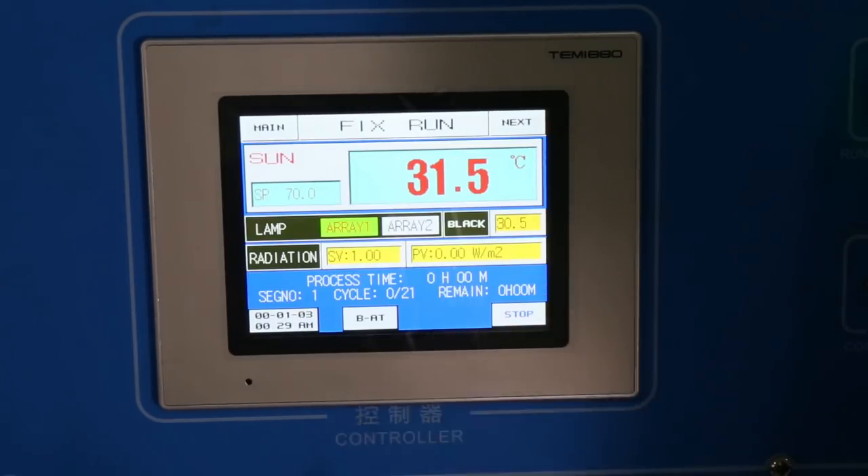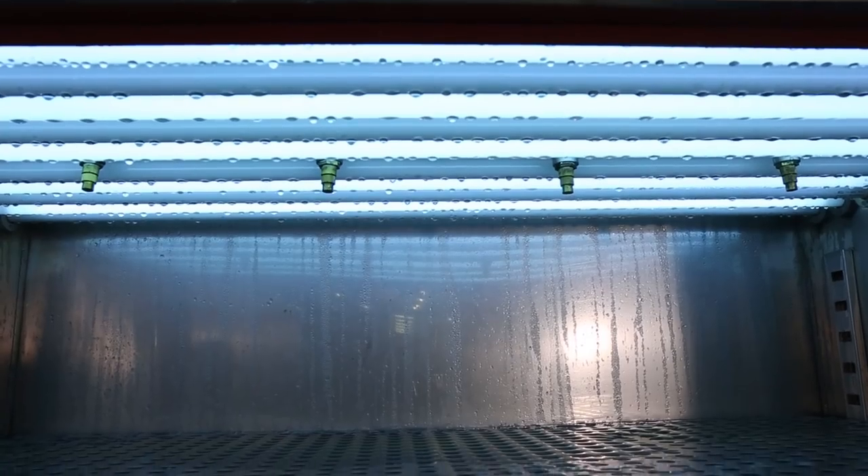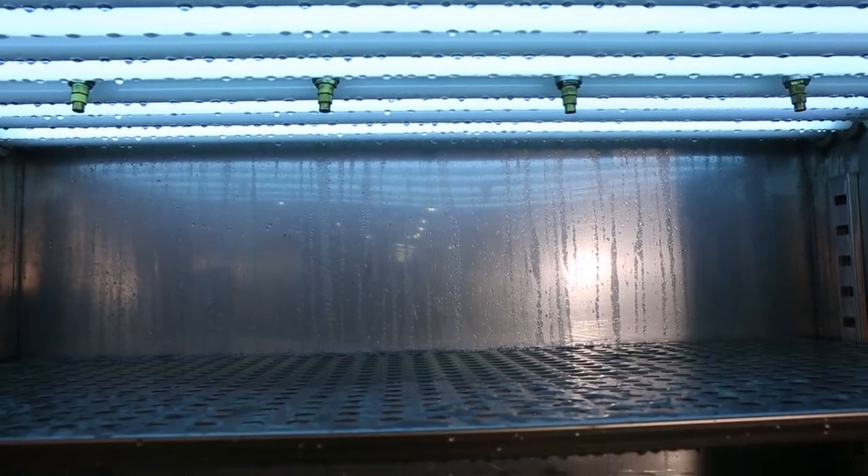Inner sides can be customized. Touchscreen controller, easy operation, temperature adjustable. With sunlight simulation, irradiance is also adjustable.